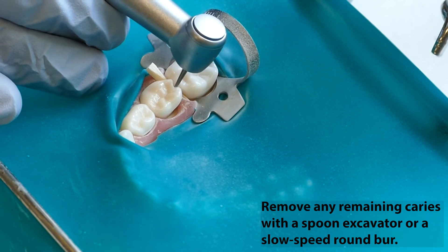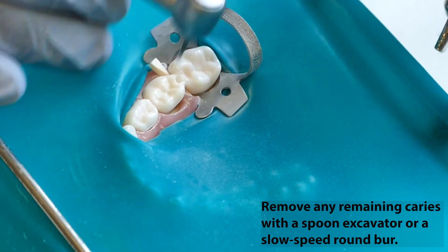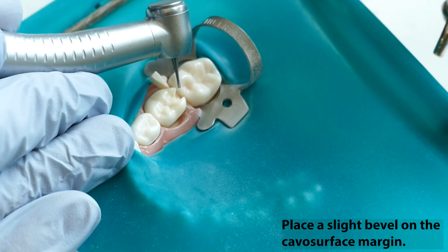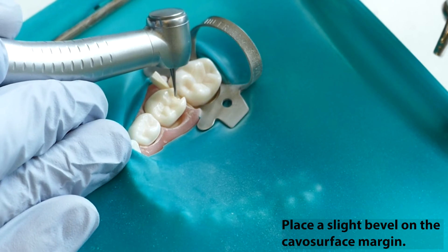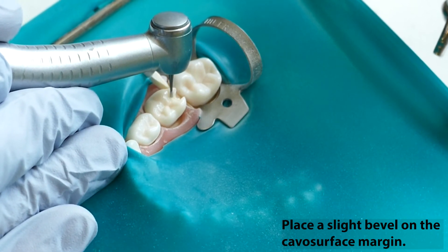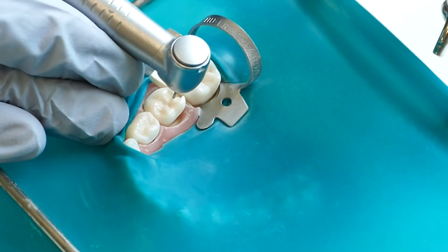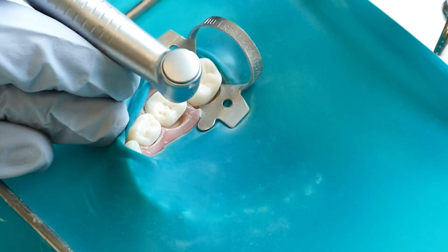Remove any remaining caries with a sharp spoon excavator or with a round burr in the low-speed handpiece. Place a light bevel on the cavosurface margin, except on the gingival wall. This is to increase the surface area for bonding and to remove the aprismatic layer of enamel. Extend the preparation on the occlusal surface as needed to remove all decay.